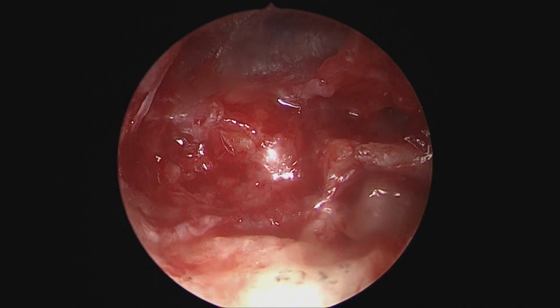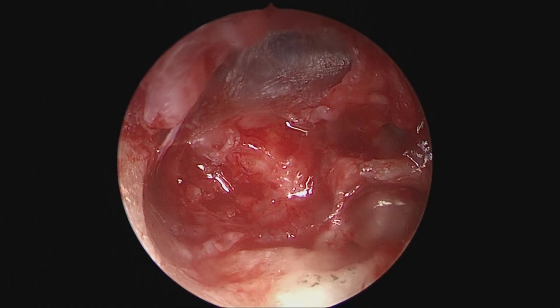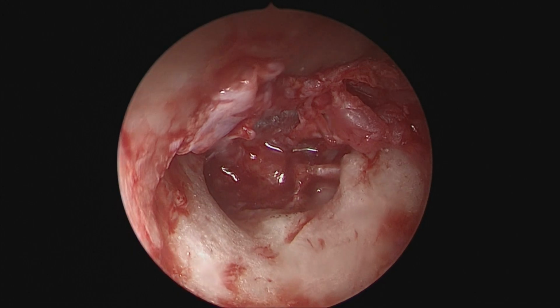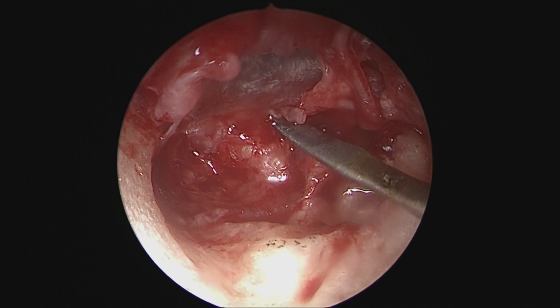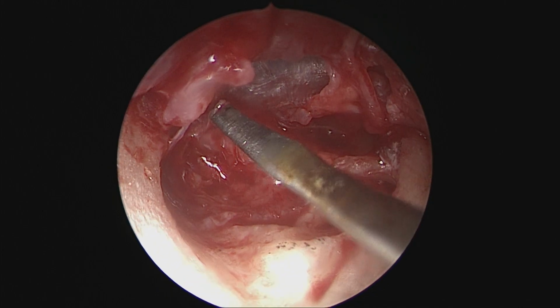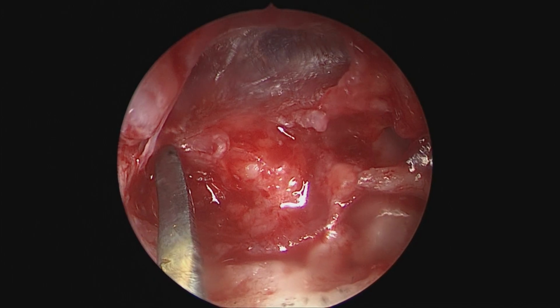We can start seeing the fallopian canal almost immediately medial to the incus long process. Also notice that there is slight retraction in the anterior drum as well, so we need to cautiously elevate the anterior remnant of the tympanic membrane to create a space for our future graft, which would certainly be full thickness cartilage in this kind of situation.